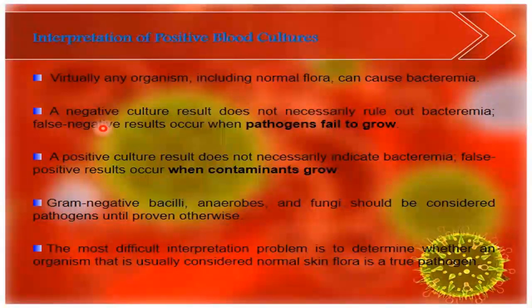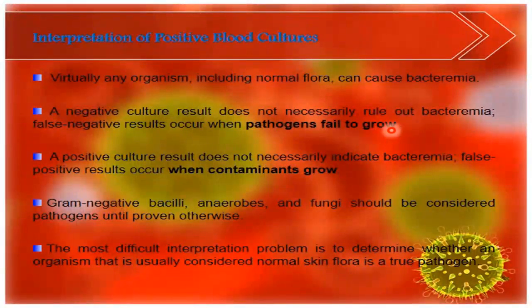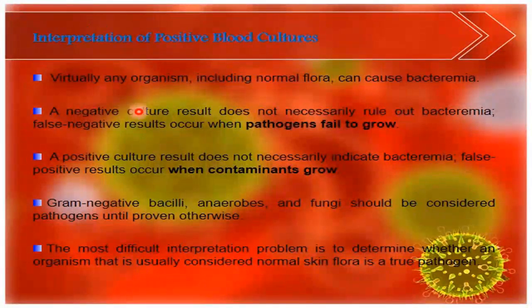Of course, because false negative results occur when the pathogen fails to grow, when the number of microorganisms is low, or when the patient is under antibiotic therapy. All of these give me a false negative culture.